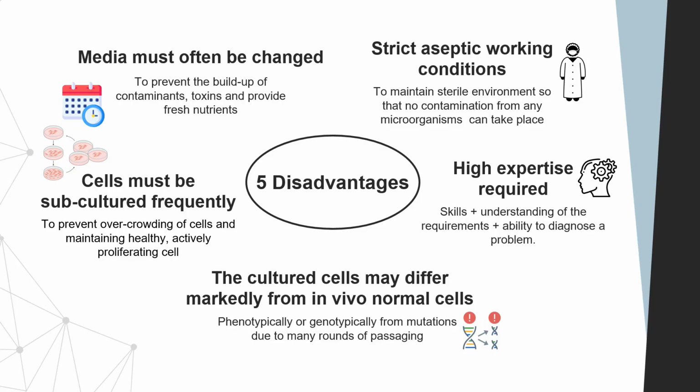However, these cell culture media really need to be changed regularly in order for you to maintain optimal conditions for cell growth. This process can be labor intensive and time consuming, particularly when you are working with a large number of cell cultures and also when you're performing very long-term experiments. Additionally, if you do an improper media change, you can disrupt the balance of the nutrients and the growth factors, and hence this will affect the cell viability and also your experimental outcomes.